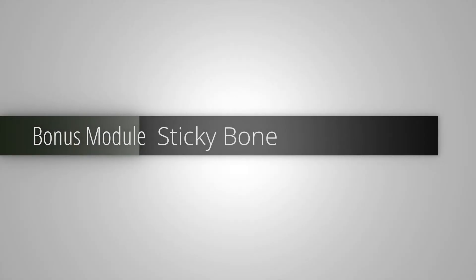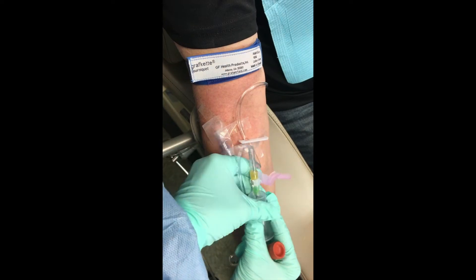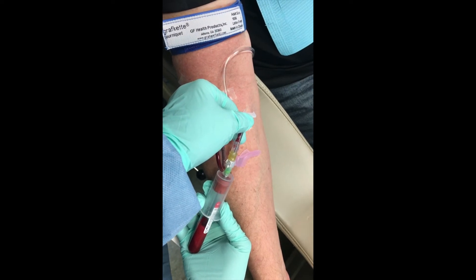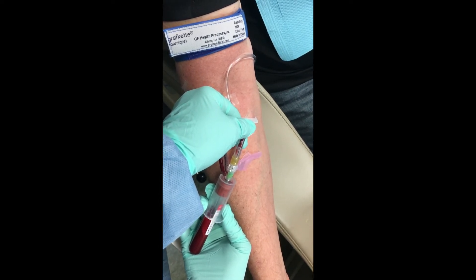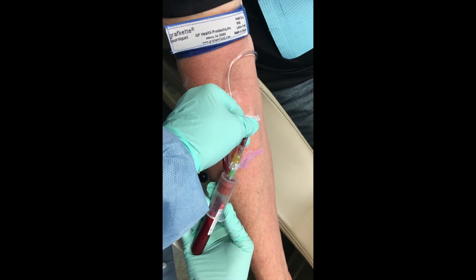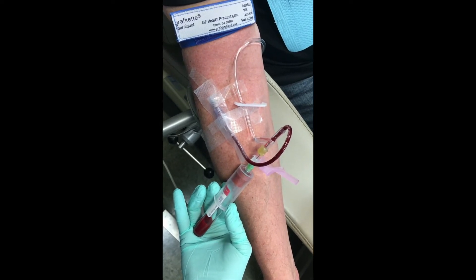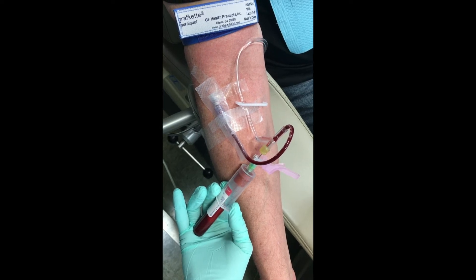This is the bonus module on Sticky Bone. It's early 2019 — a little late to the game, but I wanted to show you how we do it here in the office. This is a sedated patient with an established IV. We're using a red-top vacutainer tube. We've clamped off the IV near the access and we're doing a blood draw using these vacutainers, as you've seen in the phlebotomy section of the course. We're going to pull two of these off — she's replacing the vacutainer with a new one. After it's full, she'll take the clamp off, remove the tourniquet, and let the IV run again. The two vacutainers will then be placed in the centrifuge for processing of the PRF.